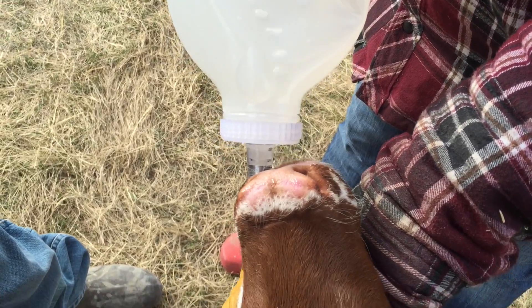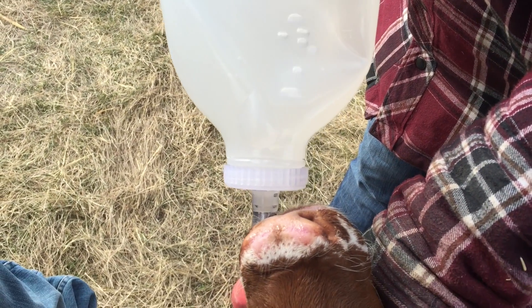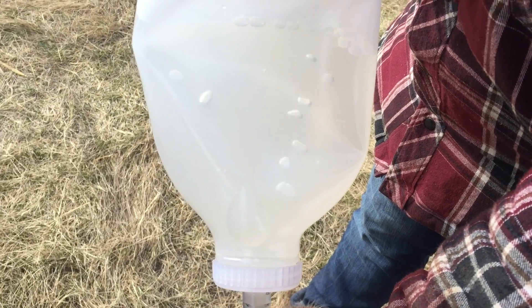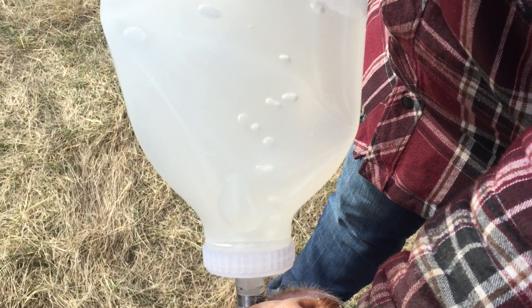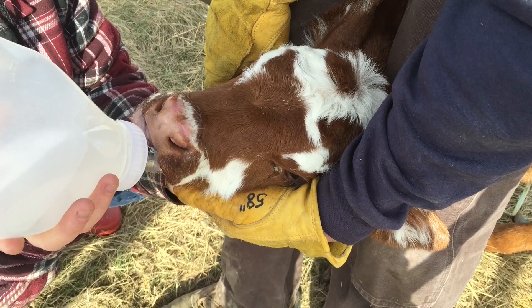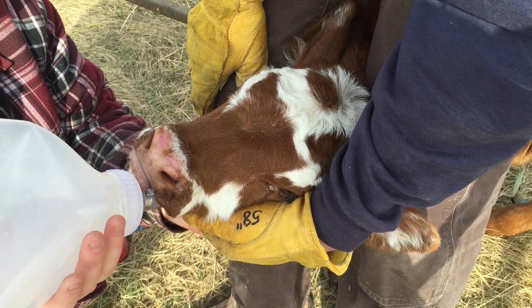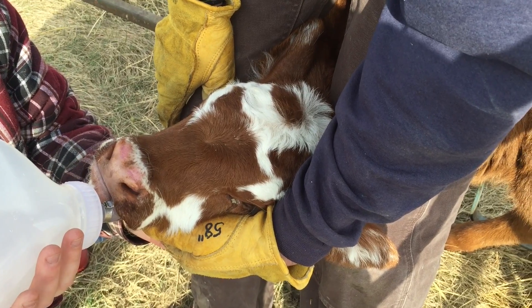There we go. There will obviously be bubbles coming up, and as I said, very important — you don't squeeze on that bottle, you just let it flow out as it needs to. This will probably take about 10 minutes to empty. At least this way she's getting nutrients. The biggest chance you can give a baby calf is just to make sure it's getting all the nutrients that it needs.